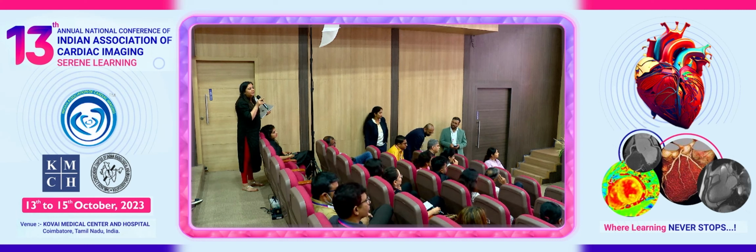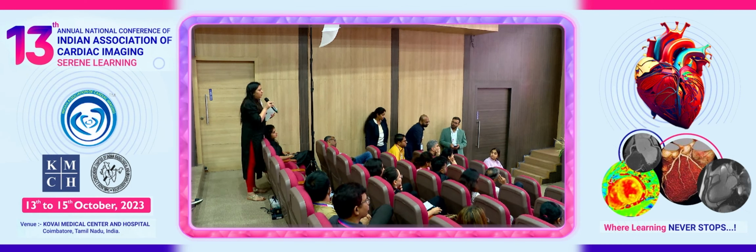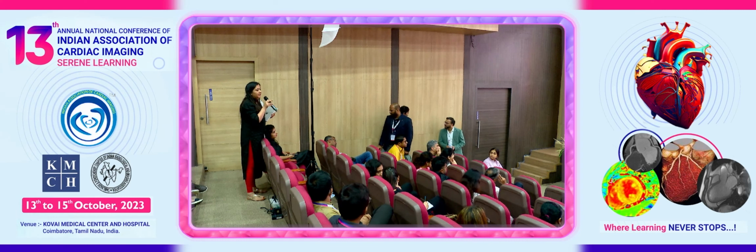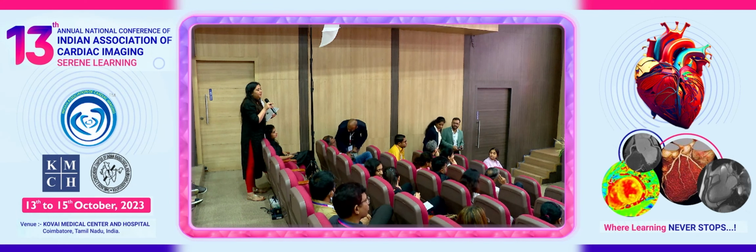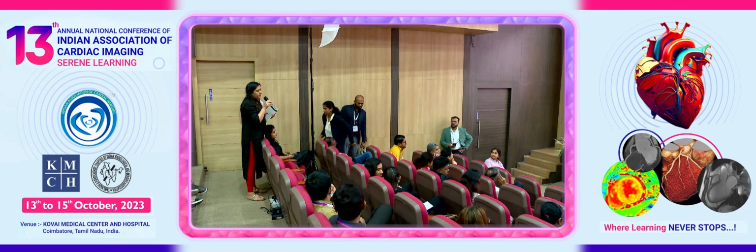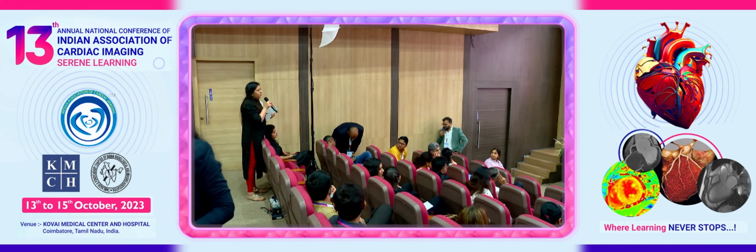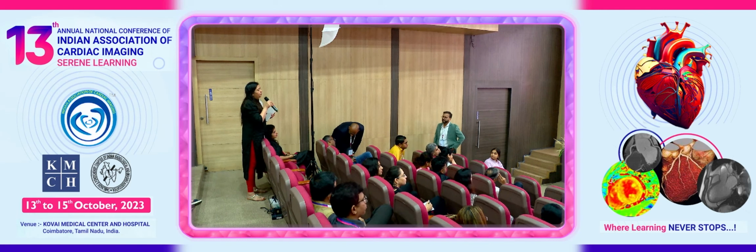So I don't think their values are going to be very close, and the amount of knowledge we give in addition to just the sizing is vast. If you are really good at it, your cardiologist will soon realize. And like Dr. Mona said, neither in her department nor in mine does any structural imaging report go out without a complete report. It's not just the CD that goes out. Unless our reports are written, the consultant does not take the patient up on the table.